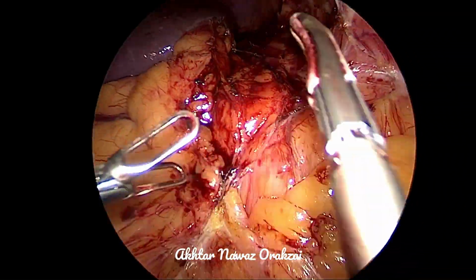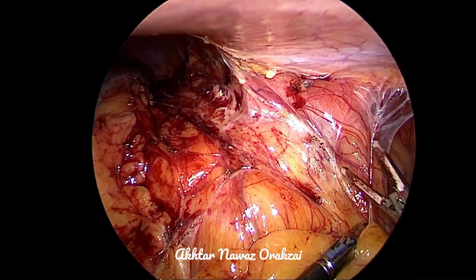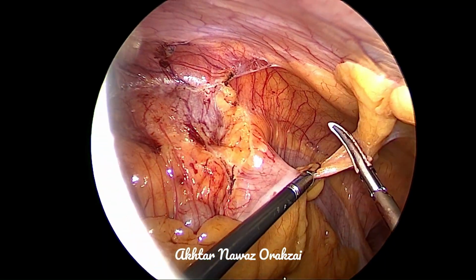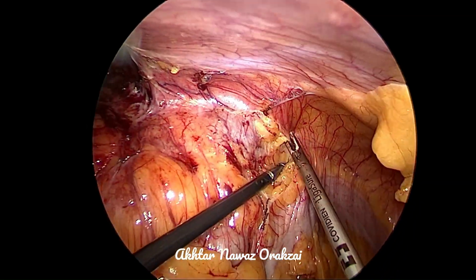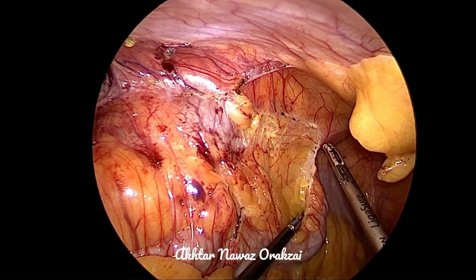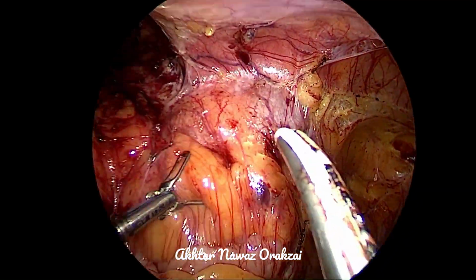So it requires a lot of patience, and you should take your time and do the dissection properly, bit by bit, and only then is it possible to be successful in such cases. So I started this video right from the beginning, mobilizing the colon medially.